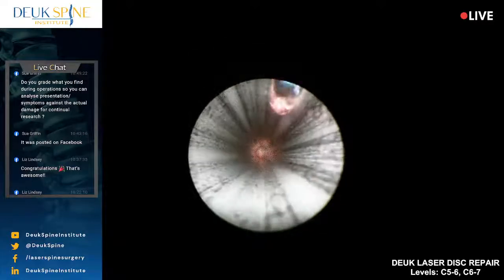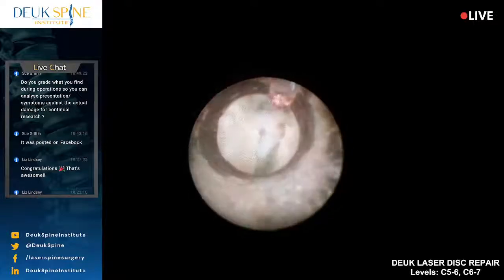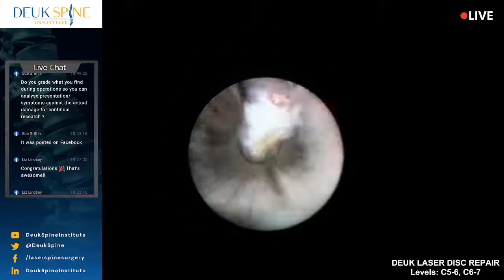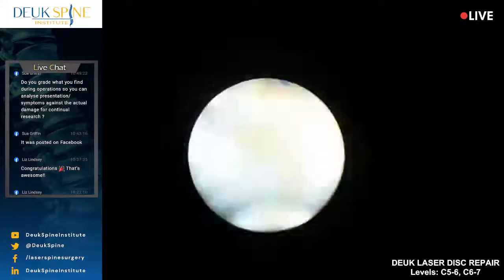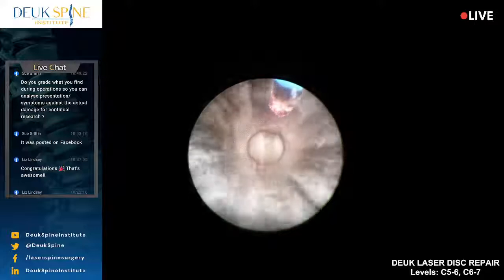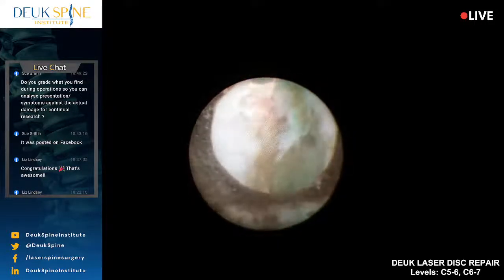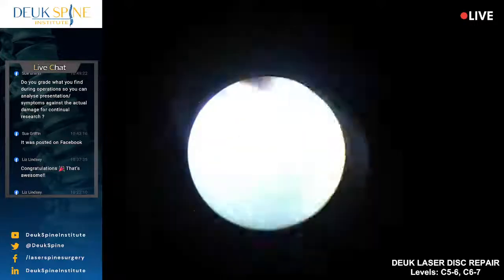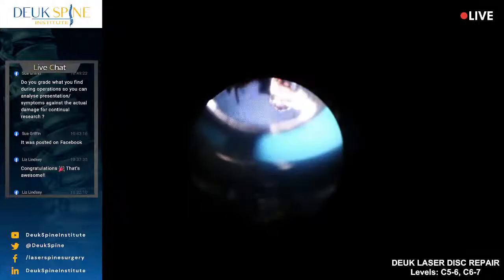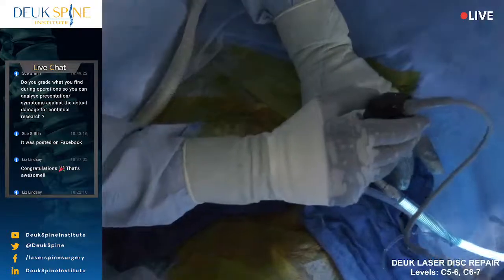Lost my laser fiber. By the way, for those of you who don't know, at 12 o'clock, that is the laser fiber. And that transmits energy from a machine in the operating room, a special piece of equipment called a holmium YAG laser. It produces laser energy, and that laser energy transmits along this glass fiber to the tip, and I basically direct the laser energy where I want it to go. I use a straight firing laser.